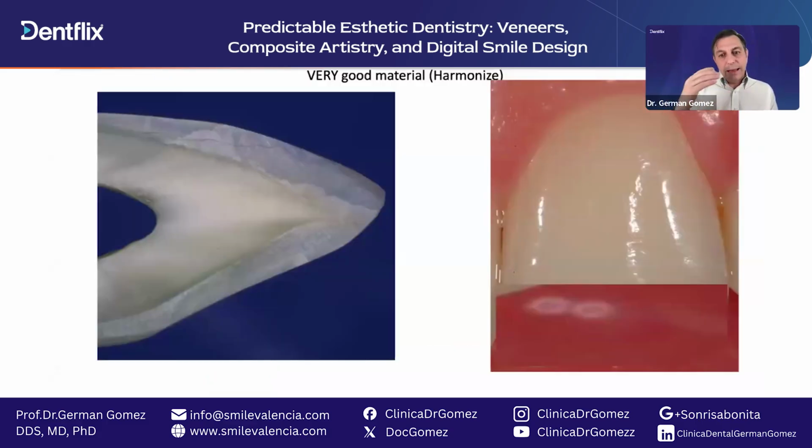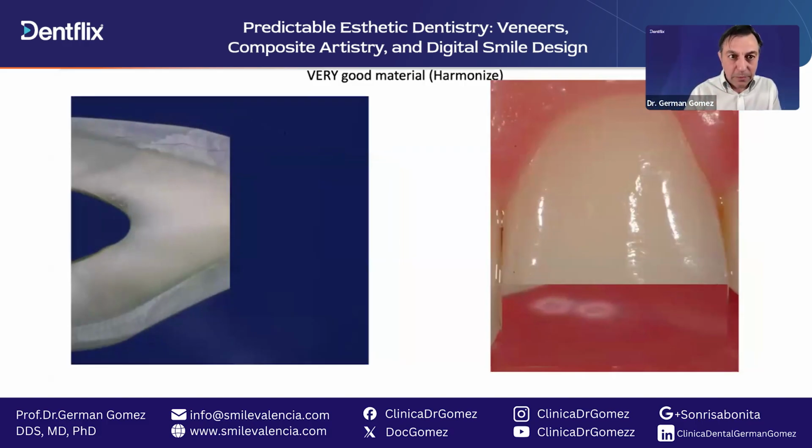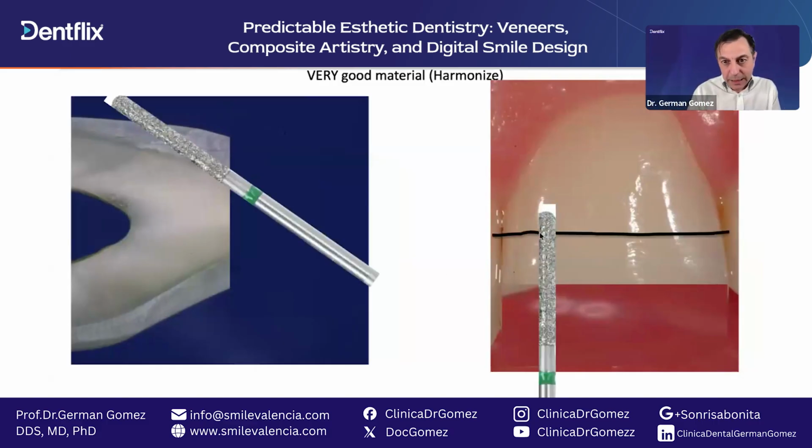So let us assume we have a tooth that broke. It broke here, so this is missing. And we want to make the bevel in the front tooth. We do double beveling. The first bevel would be here, going from here to here.